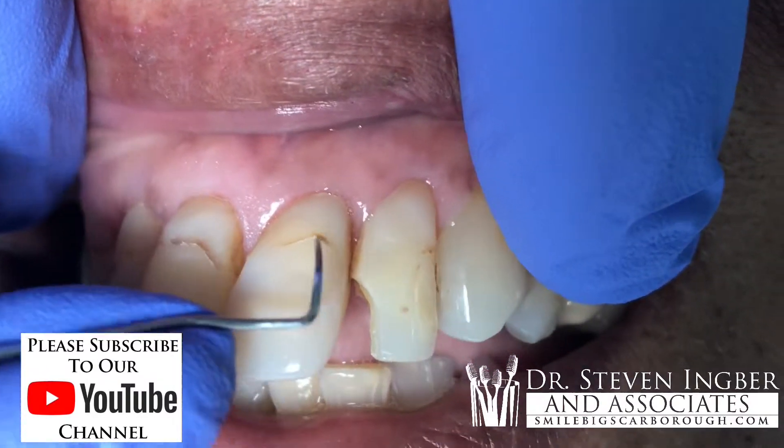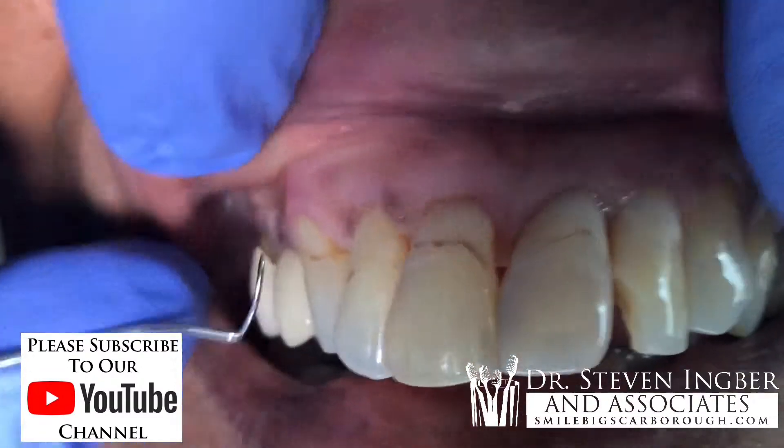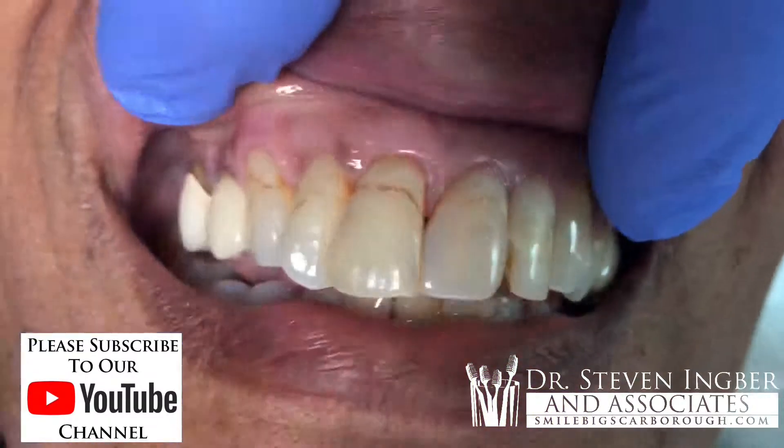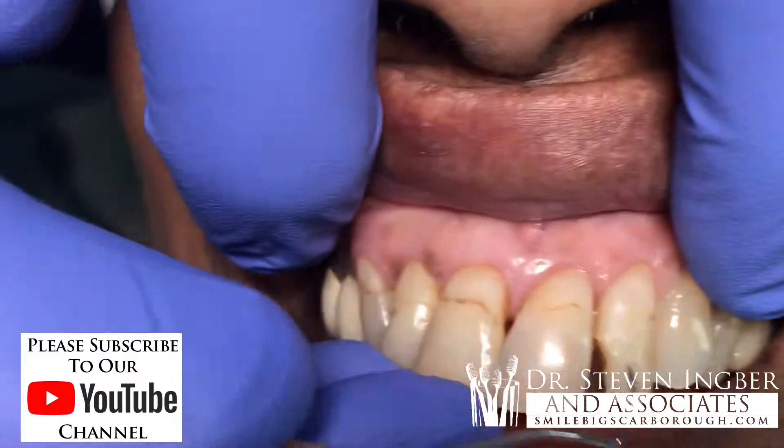So what we do here is we're going to take these, buff out this stain, and then put a new filling over it and seal it up. You can see all the sides there — there's one, two, three, four — and she also busted up this tooth in the front here.